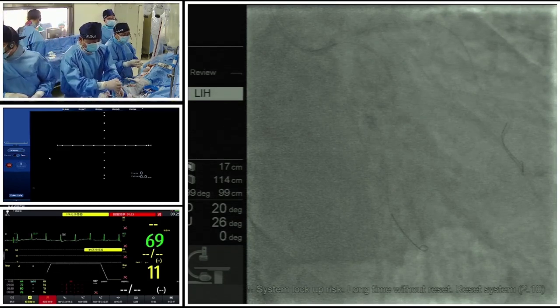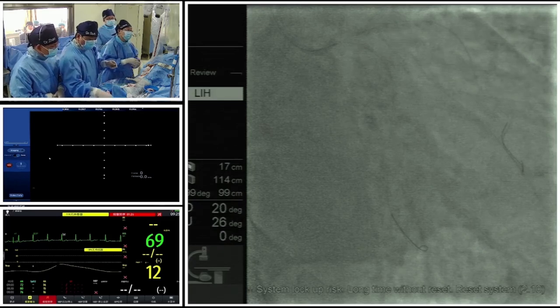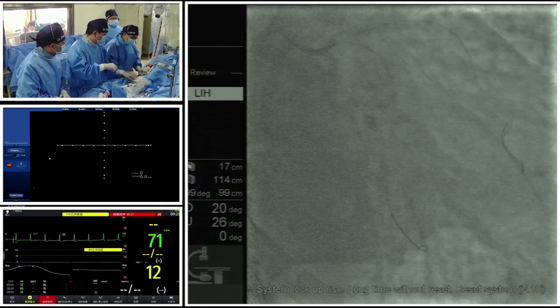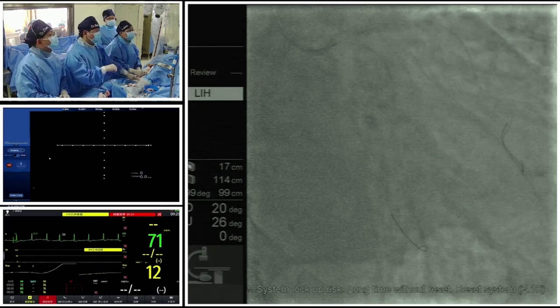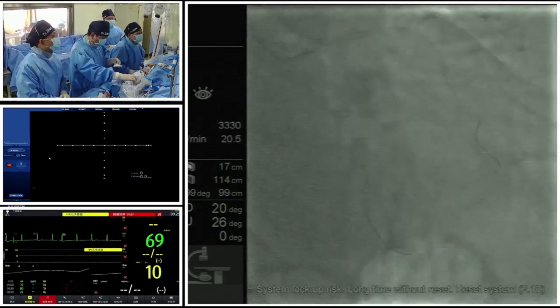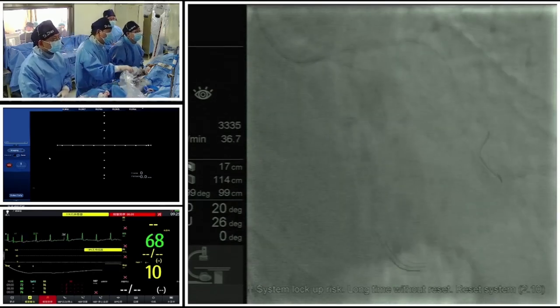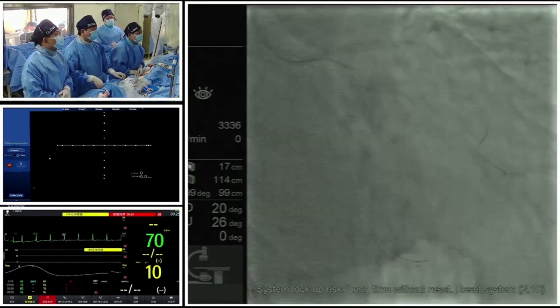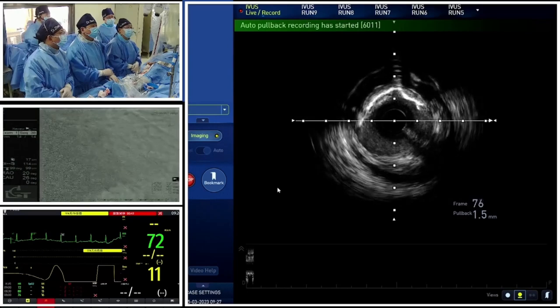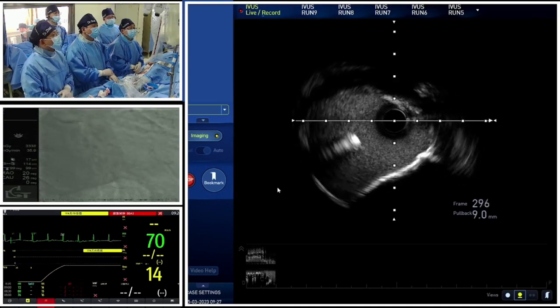And we will perform intravascular imaging from the circumflex to confirm the morphology of the distal left main and the ostium of the LAD. For calcified lesions, imaging can give us a lot of important information. If we just base it on angiography, we may make the wrong decision. So we have the information from IVUS and from the CT angiography, and then we can make the right decision. From the angio, the left main is very short, so now you want to check its morphology, one more IVUS run from the circumflex to the left main, right? Yes.